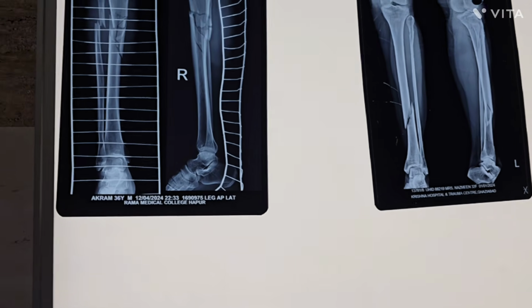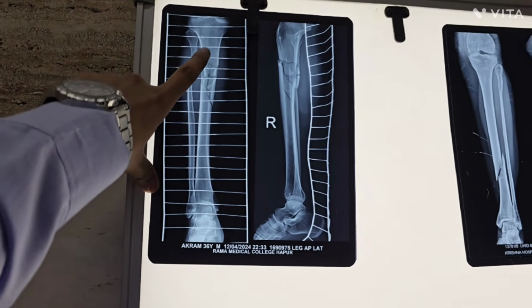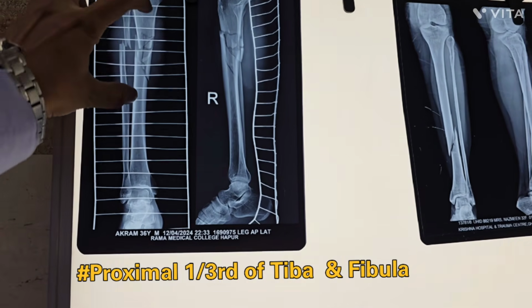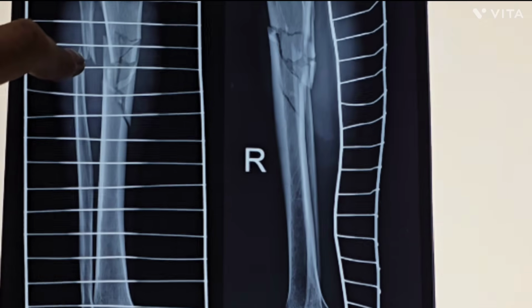Okay. So what is the problem in this case? You can see the fracture: this is a fracture of the proximal 1/3 of the tibia and a proximal 1/3 fibula fracture.